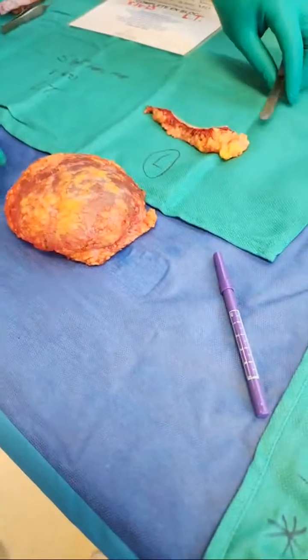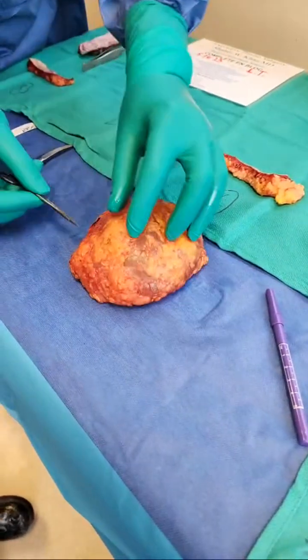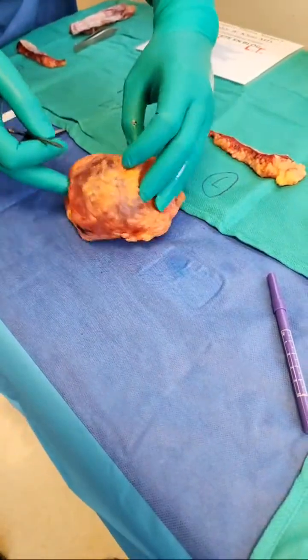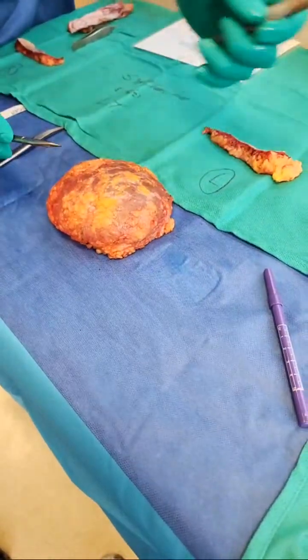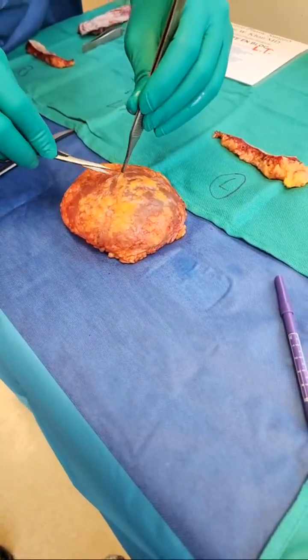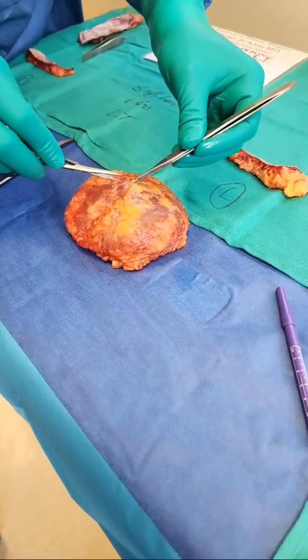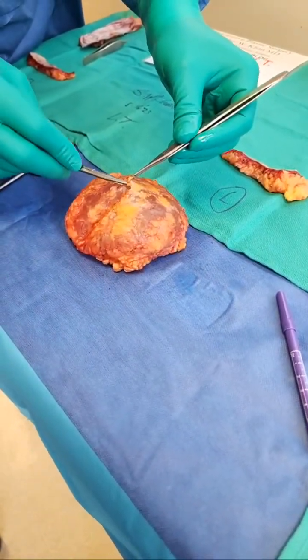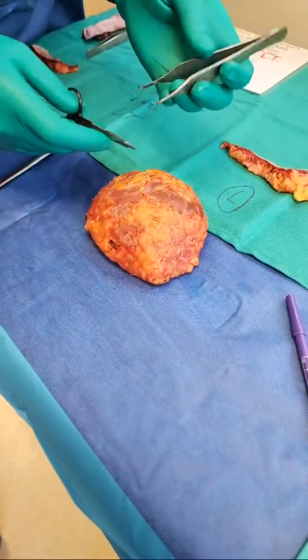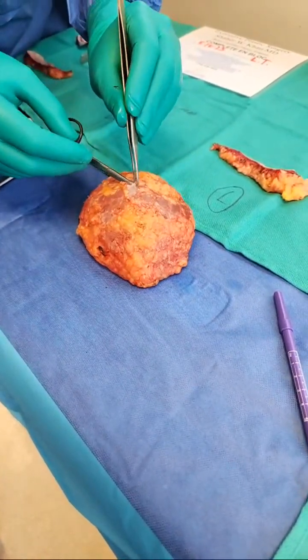So what I'm going to do here is, again, cut out the excess skin. That really helps with the aesthetic contour. You can see the pointed nature, and how it has folded up on itself. What I'm going to do next is go in from here. Again, this looks like an intact Allergan implant.